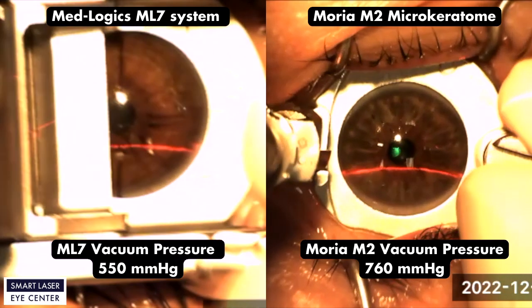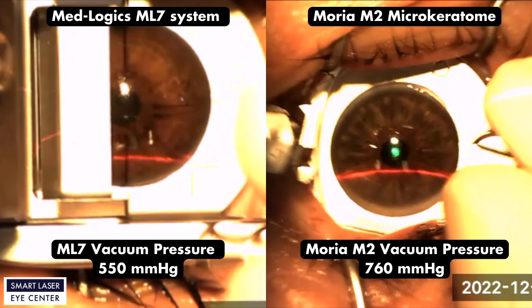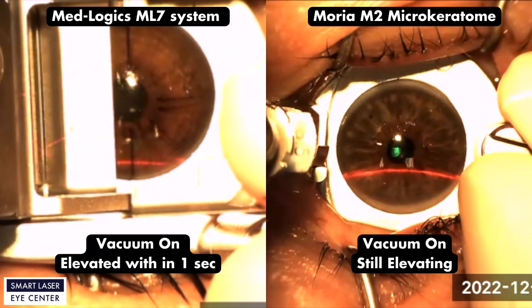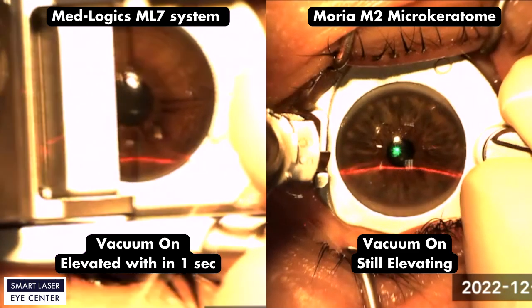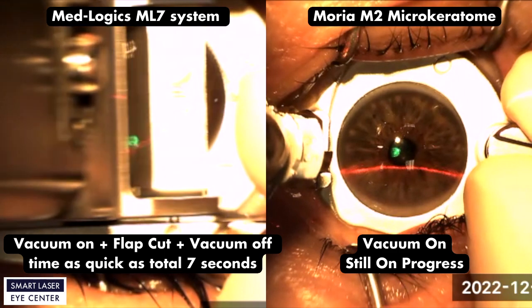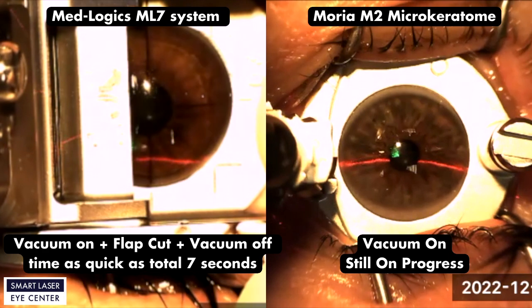MedLogic's ML7 system vacuum elevated up to 550 mmHg in 1 second, and Moria M2 system vacuum elevated up to 760 mmHg vacuum pressure. As you see on the video, the ML7 can create the flap as quickly as 7 seconds from the time the vacuum ring is placed in the cornea and removed.